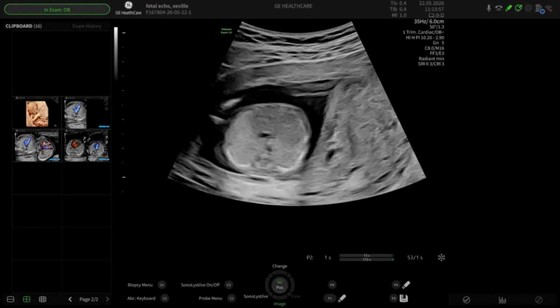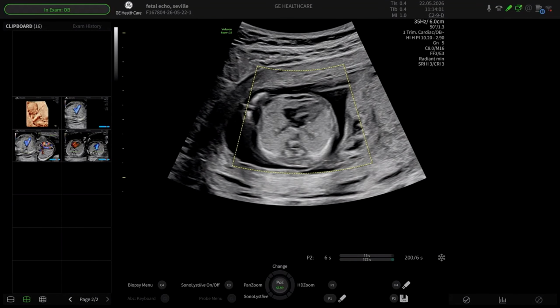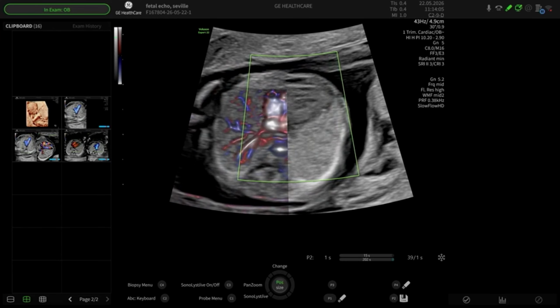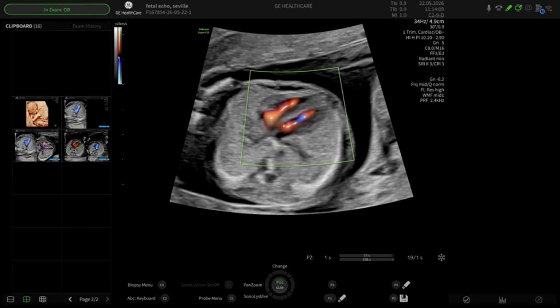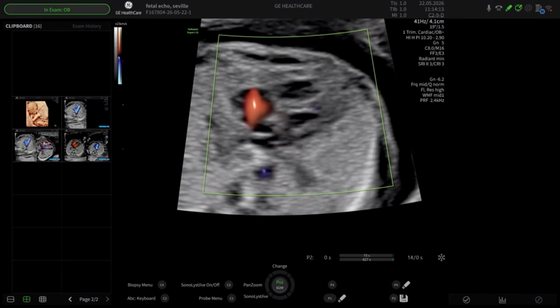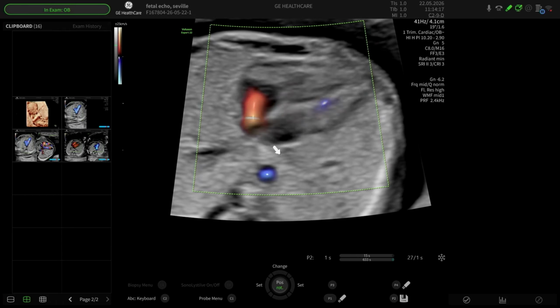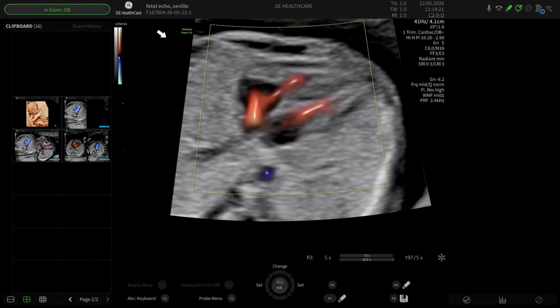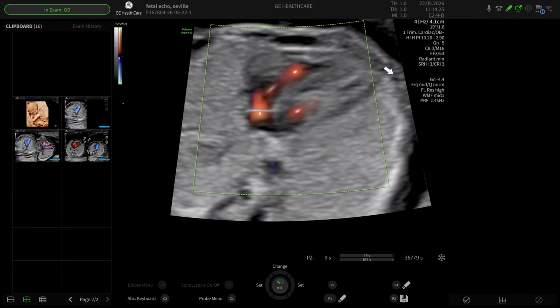Coming back to the screening context side of things, if we go back, the heart, the apex is now in a better position. So in that position, I'm going to go back to taking slow flow off, and I'm going back to using color. As I do that, you will see for every image that I'm taking that they are very magnified images demonstrating flow in the heart. I go back to my starting principle every time I do anything looking at any vessel. I go to my PRF first, I then go to my output, and then I go to my gain, the order of those three things.